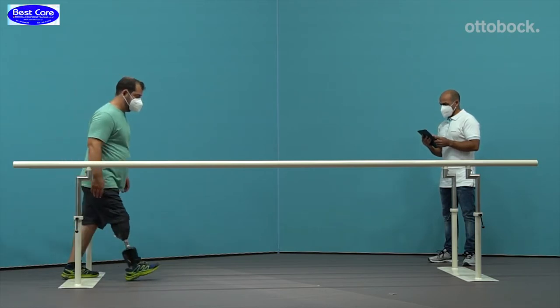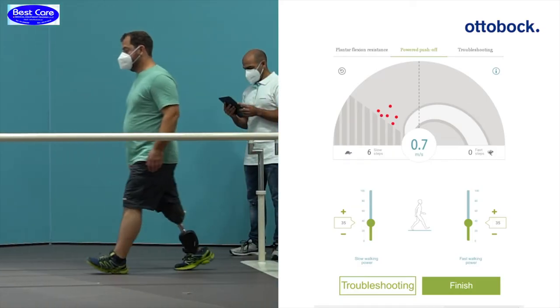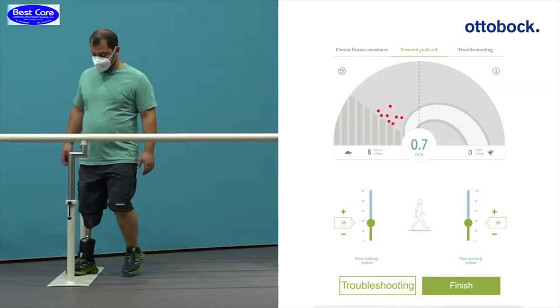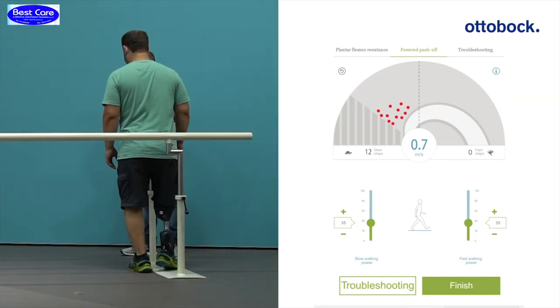In this example, the settings for the power push-off at slow speed are too high. The steps plot above the white optimal range. Decrease the setting for slow walking power until the dots appear green within the optimal range.